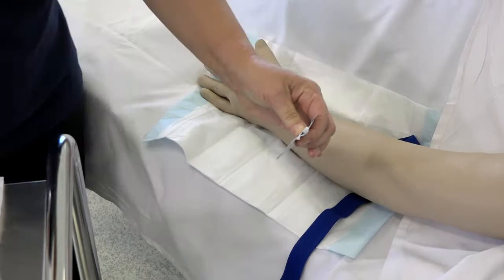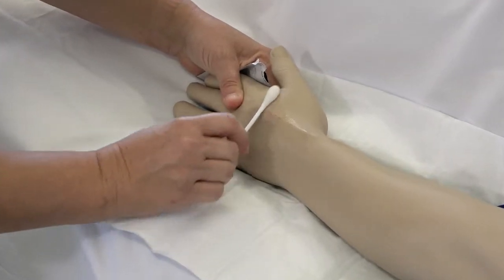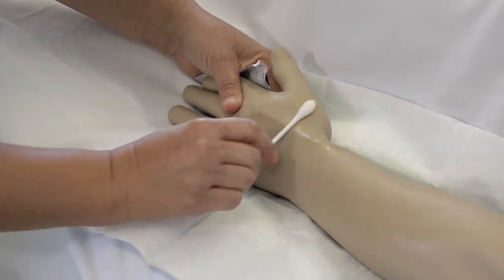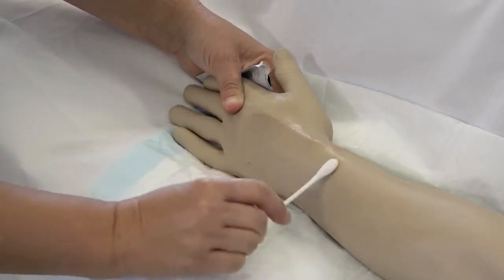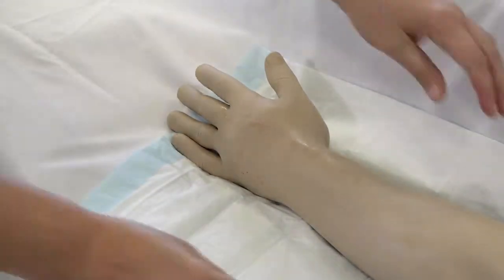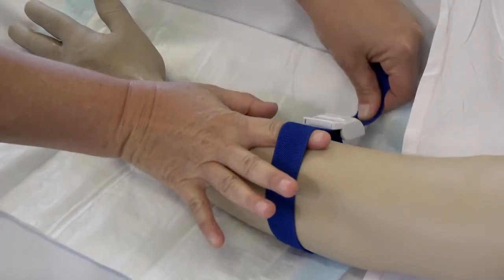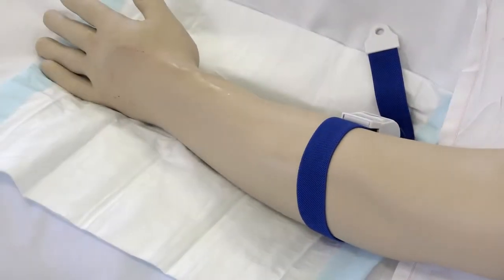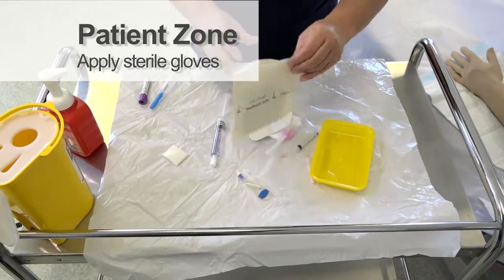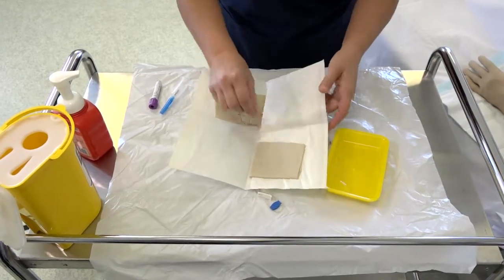Swab the area you have selected for cannulation using an up, down and side to side pattern for at least 30 seconds and then allow to dry. Re-apply the tourniquet.